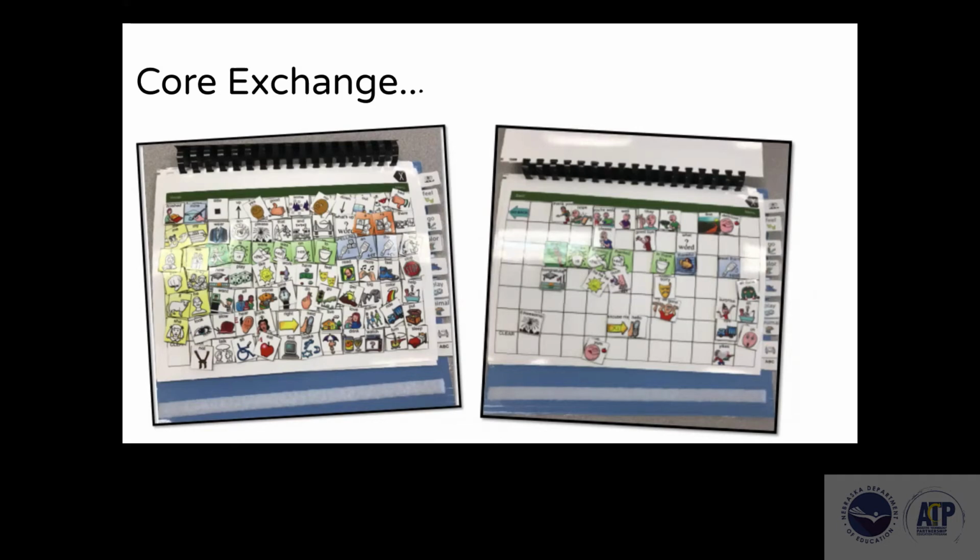And it was a little bit cumbersome because we want communication to be as seamless and easy and not seem like work. But because he really did put these together and it took a little bit of time, he quickly realized that and went back to his device. But it was really neat to actually see how he was expanding his language more when we made it more low tech, and it taught him the power of putting together those phrases. And so that's what that looks like.